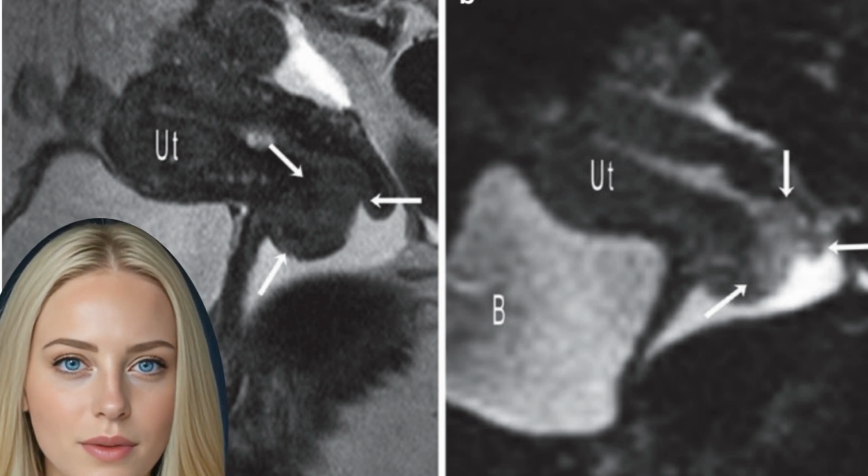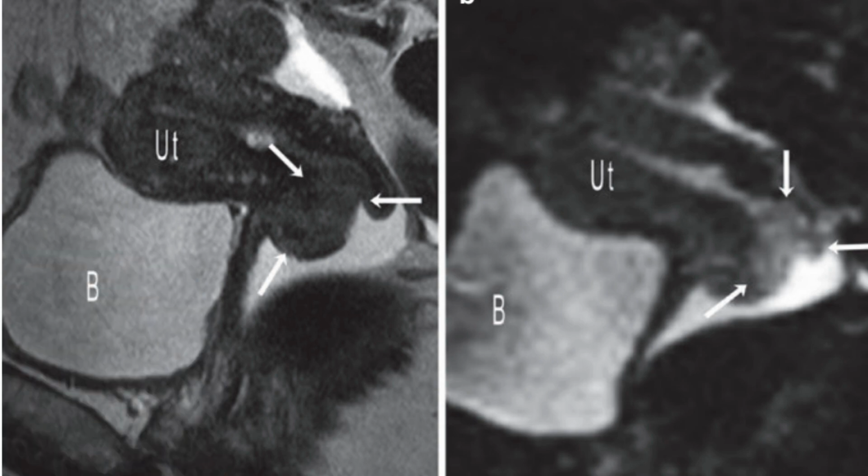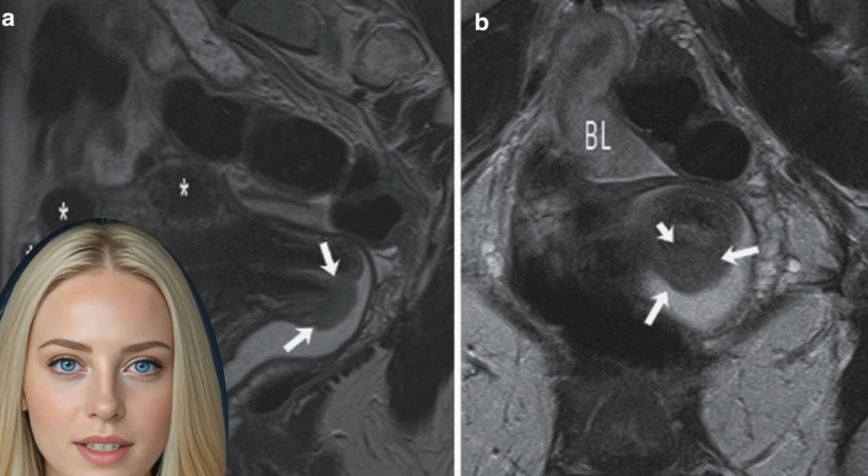expands beyond the serosa, a blurred reticular streaking can be expected. A bladder or rectum infiltration is to be presumed when the fat layer is missing. When solid tissue expansions in the lumen can be proven, an infiltration is the case. PET/CT has a standing in the diagnosis of distant metastases and in the diagnosis of recurrent disease.